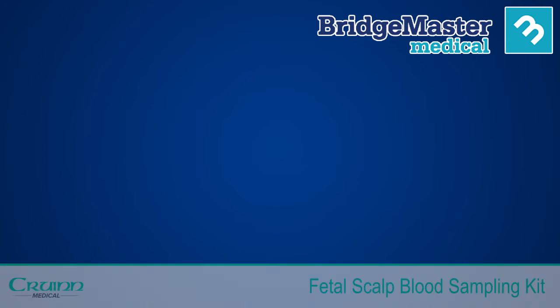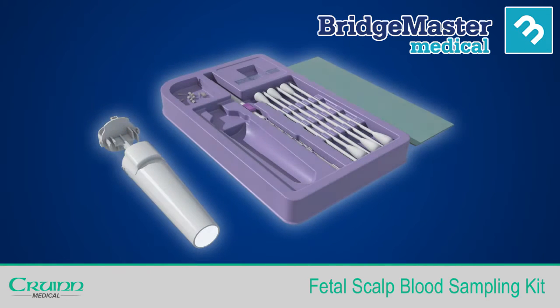Bridgemaster Medical introduces one of the world's first fetal scalp blood sampling kits, which has a single-handed operation and does not use petroleum jelly or Vaseline. This animation will provide you with technical instructions on how to use the kit in order to take a successful fetal scalp blood sample. This does not replace any of your current hospital protocols.